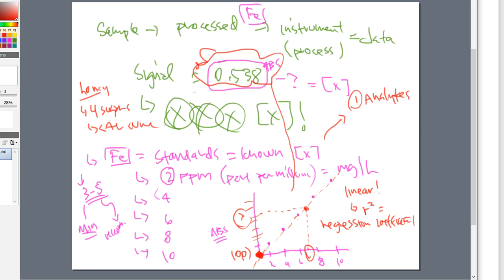All right. Next up, I'm going to have to do it with the surrogates as well, because the surrogates, we need to know how much is there. We need to know what the amount is. All of that process has to take place accordingly and the proper way.